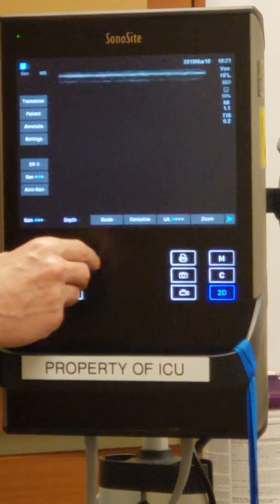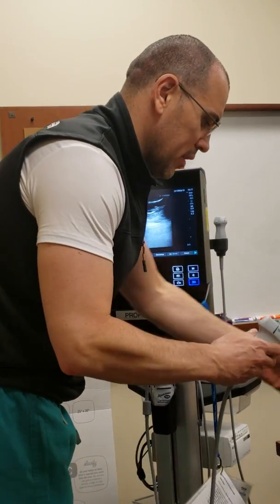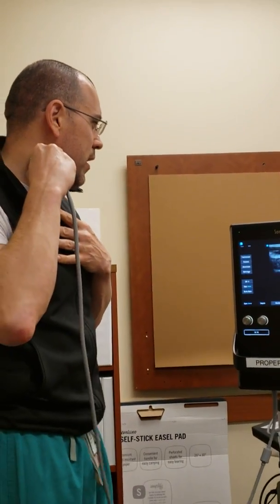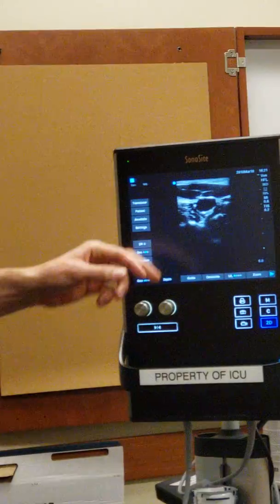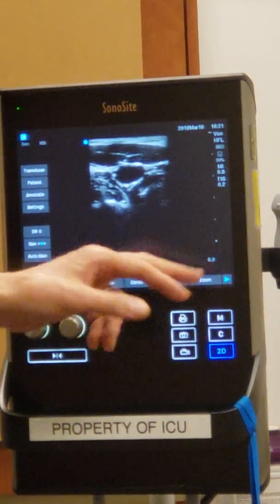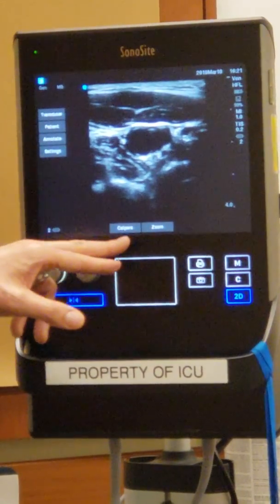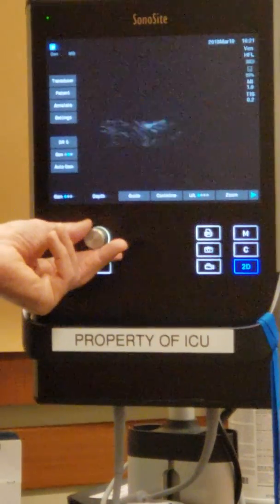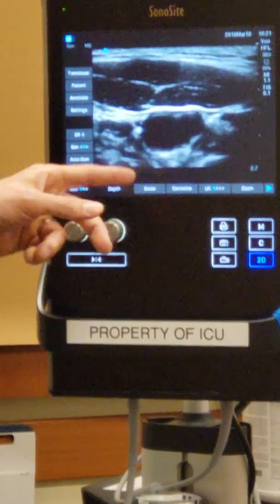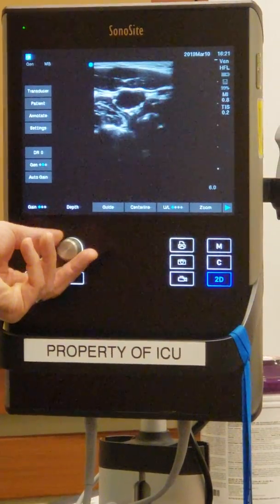Let me quickly show an image to drive this point home. Here I'm looking at my own internal jugular — there it is, me collapsing it. It's relatively small here. But if I see six centimeters on the side and I change the depth to come up, it makes it bigger. I can make it even bigger by going shallower. It's much easier to see at 2.7 centimeters than at six centimeters.